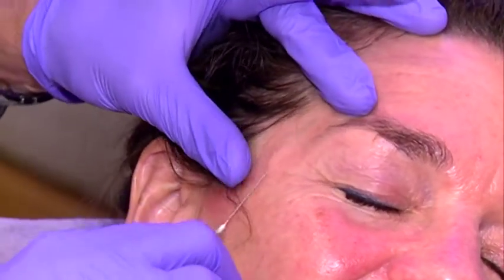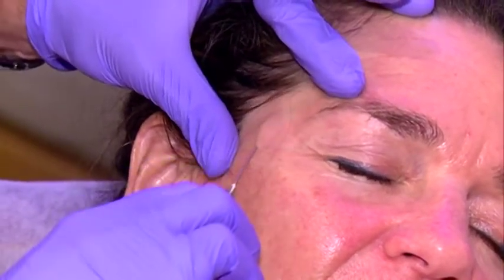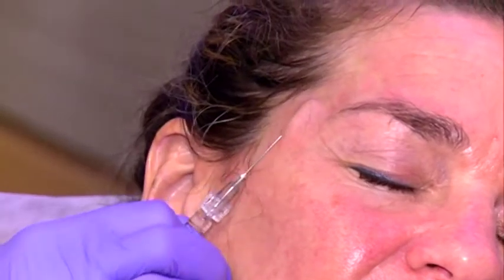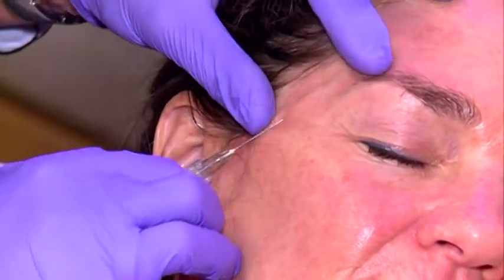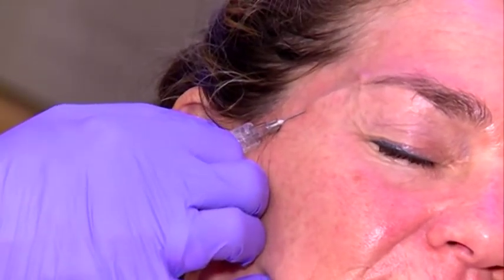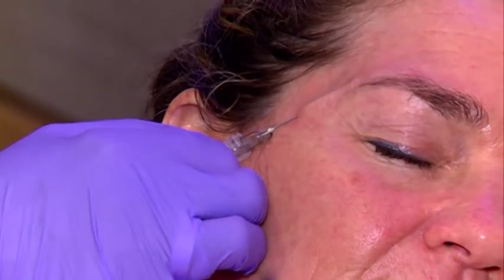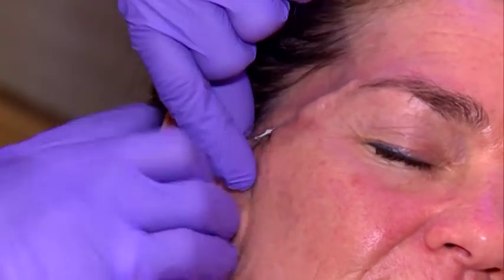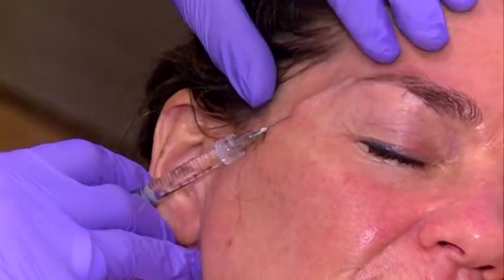Torsten, can I ask you a question? Yes, sure. For those of us who haven't done it, how do you know you're subdermal? Is there any way? You do not know, you have to see the visibility of the cannula. That's the only one which you never know, if you're subdermal. I have done so many courses with Sebastian on temples, and we have done the dissection afterwards. But it's never 100%. If somebody tells you he's 100% sure he's in the subdermal tissue, he's lying.